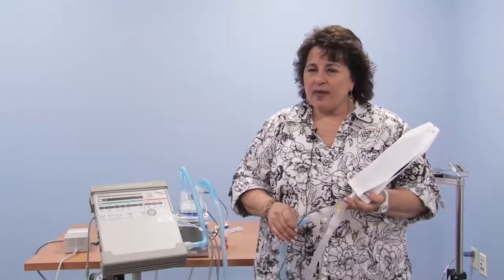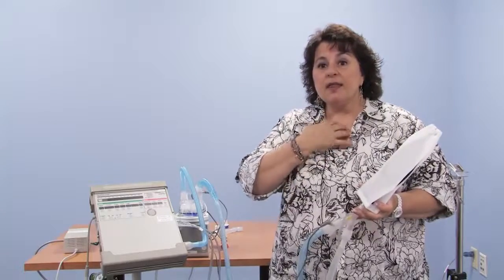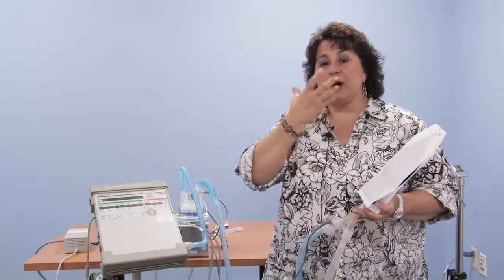So we don't want that to happen. If we can get away with a sensitivity of 2, we will do that, 2 or 3. Typically not more than that. If the child has a tracheostomy tube and the cuff is absent or deflated, the air will leak from the lungs out the nose and mouth.